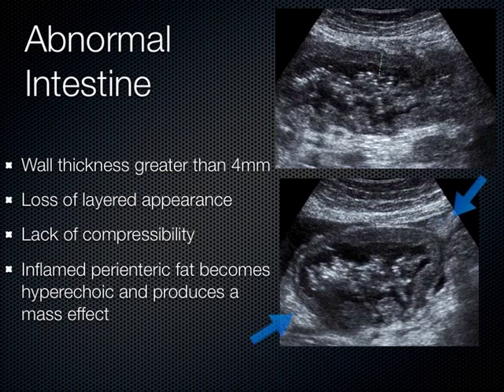And if you look around the edges of this, stuff that's inflamed always appears hyperechoic, very bright. And we can see around the edges of the structure here, it's got these hyperechoic areas. And when I compress them, it exudes this mass effect. It all kind of moves together as one unit. Now, intestines should easily flop around each other and slip around each other and should slide amongst one another. When there's inflammation or abnormality there, then it all moves together like a unit. And this is an example here of a patient who had pseudomembranous colitis.